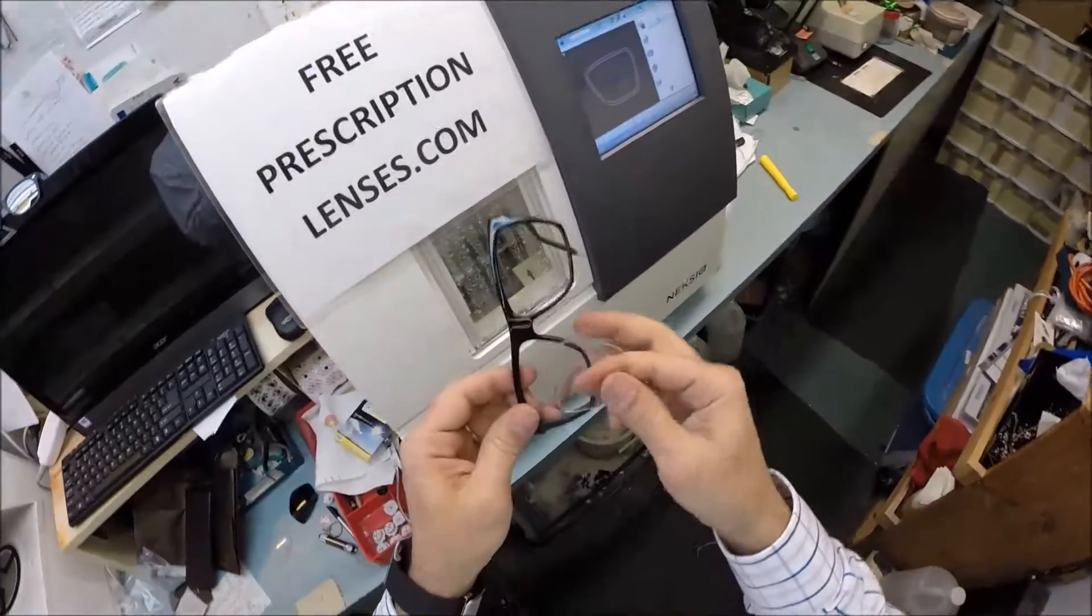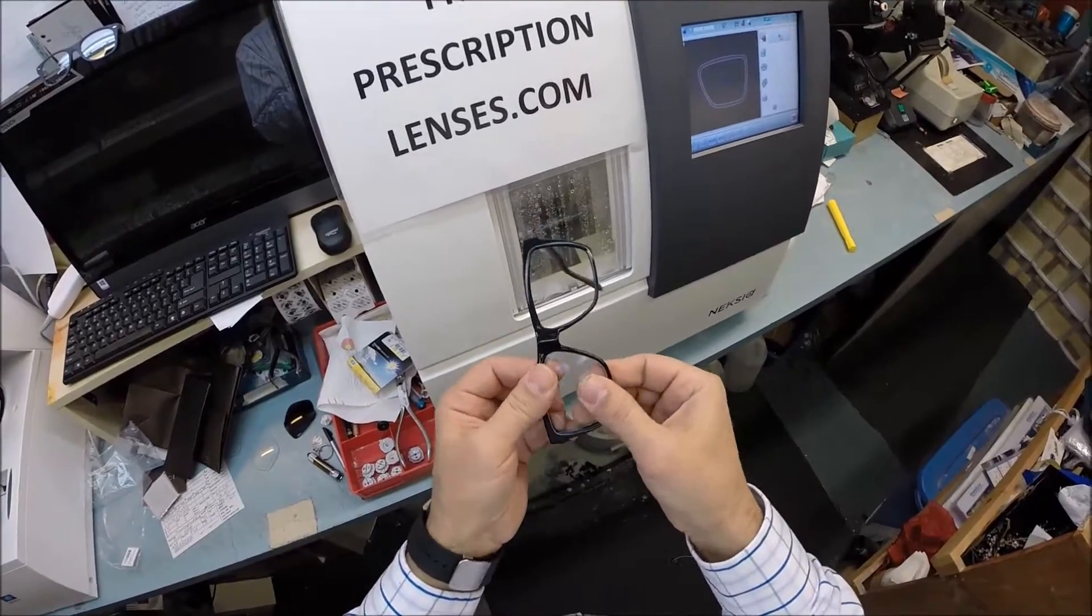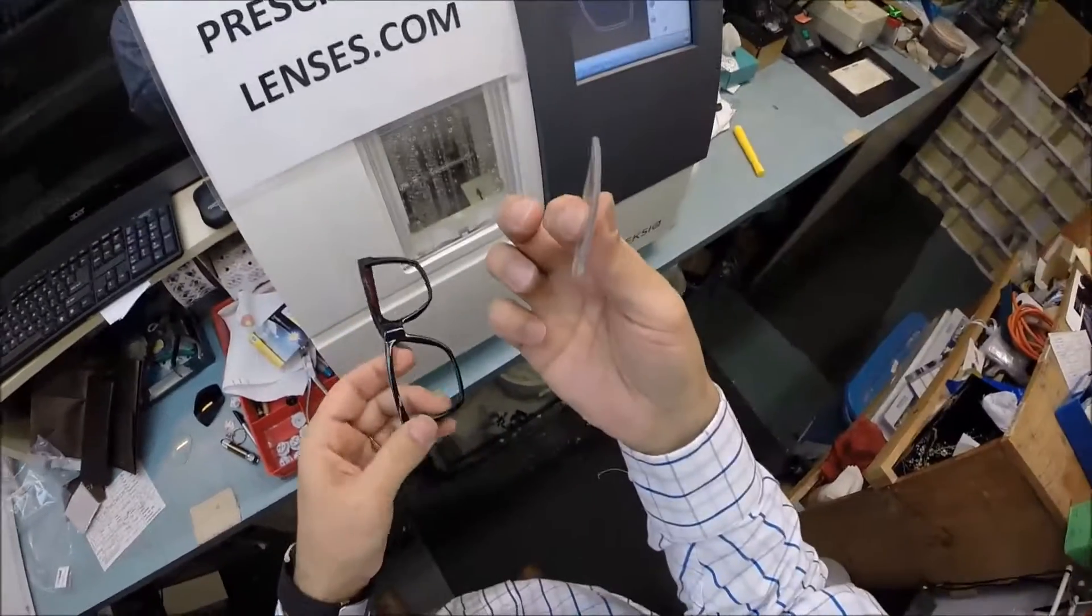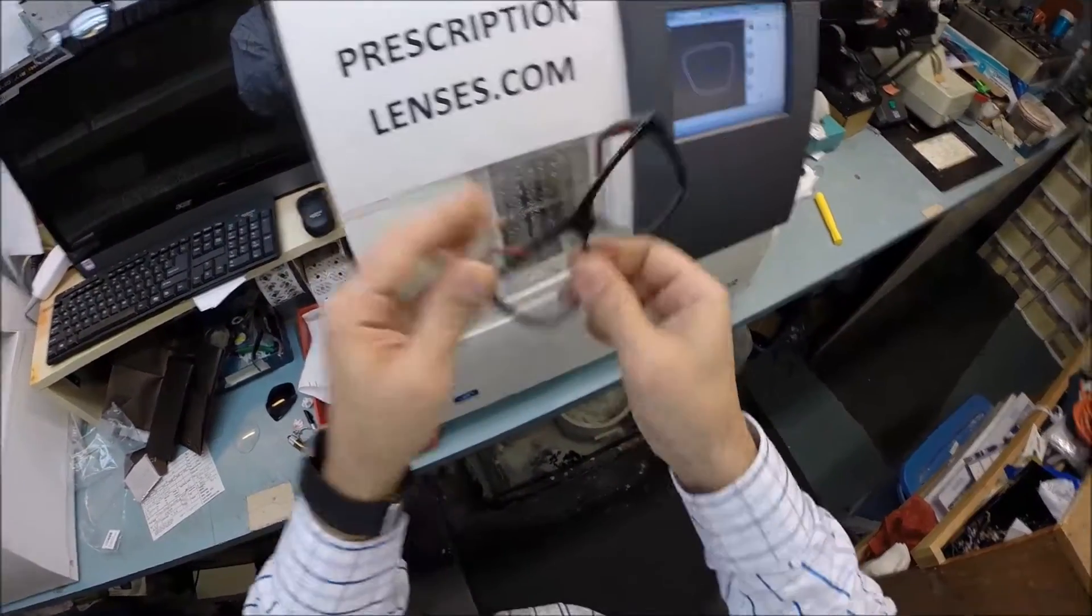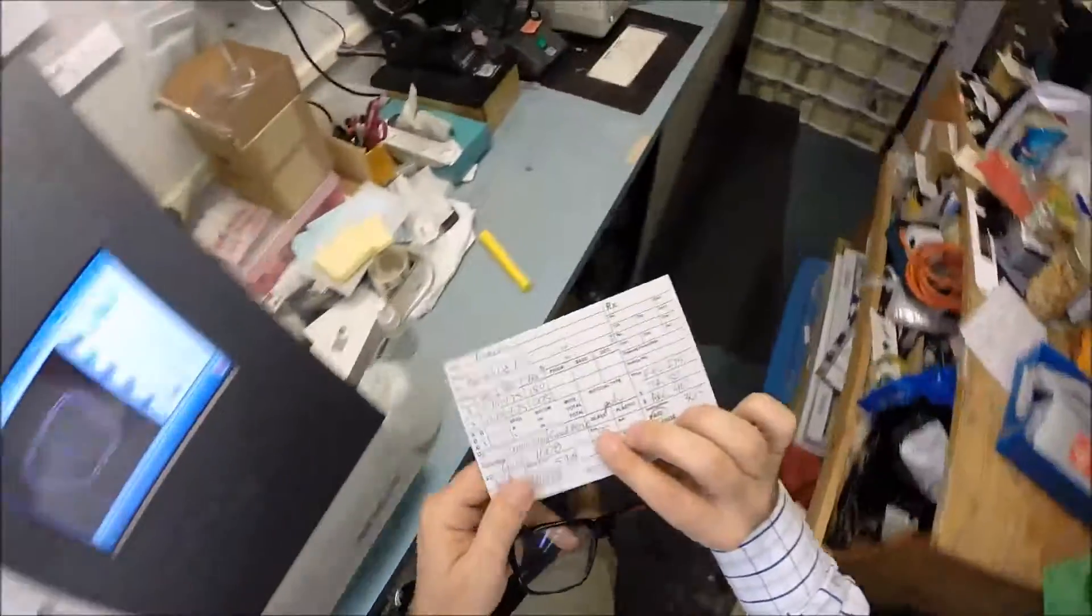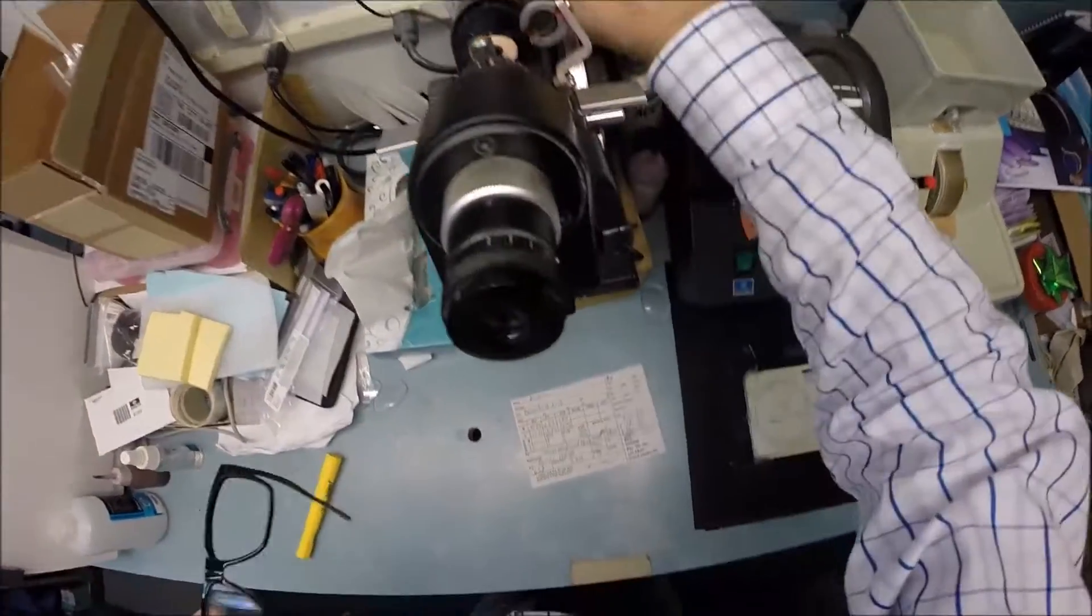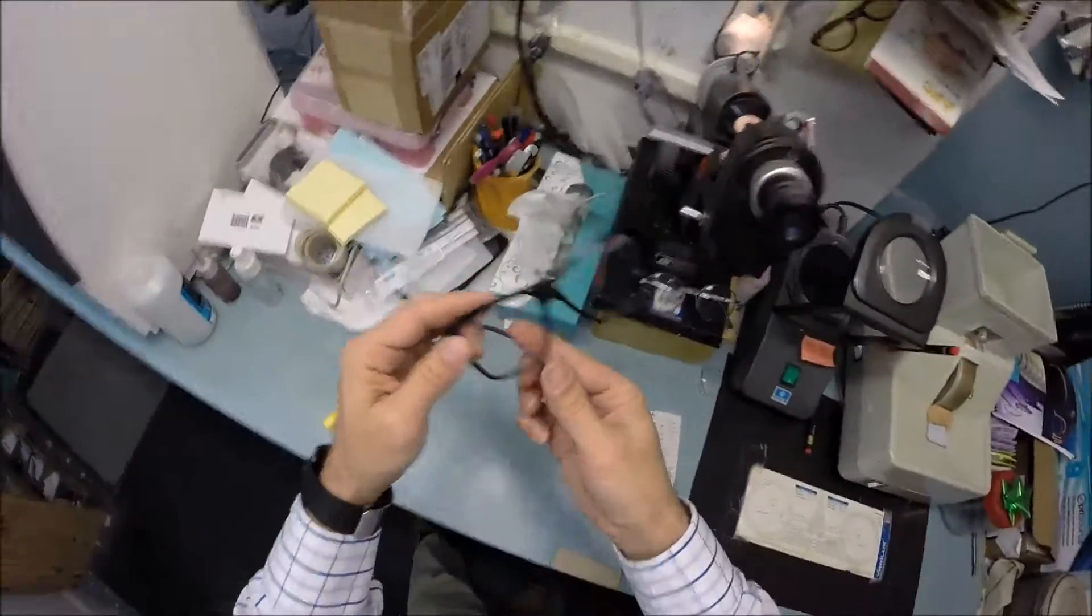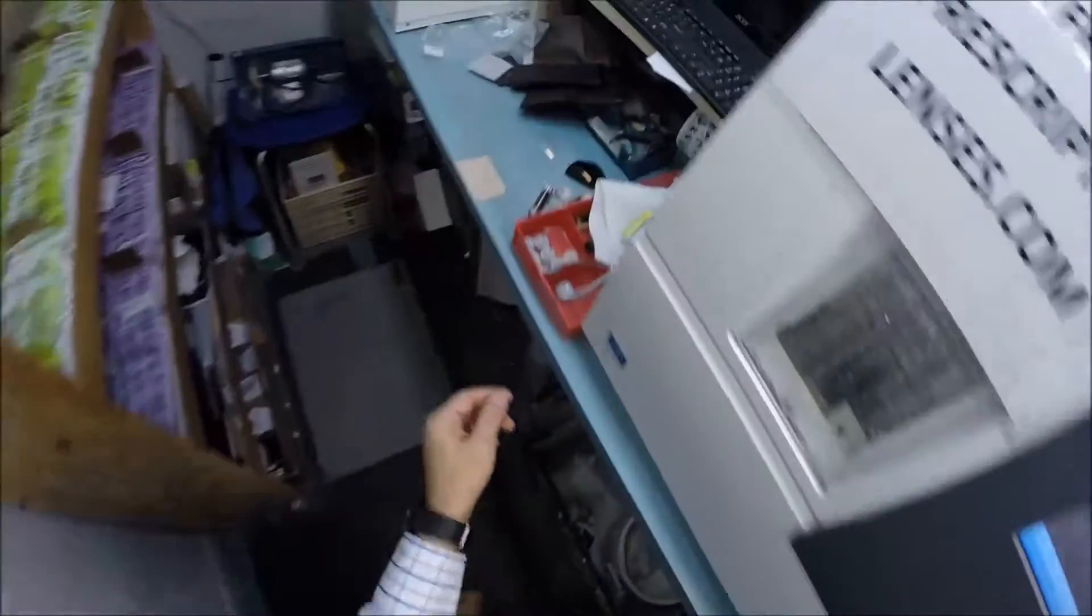I'm going to go ahead and inspect your right lens. I'm going to spin the axis wheel back to 180, which is zero. Put it in over that red dot that I still have on your lens, which is your optical center. Spin the axis wheel and I'm getting minus 75.